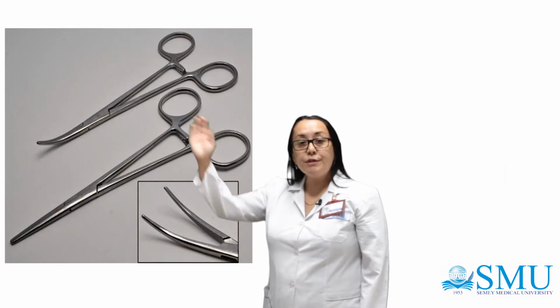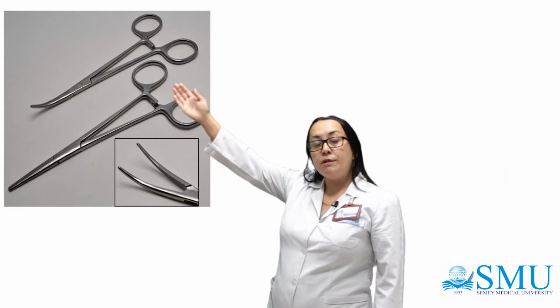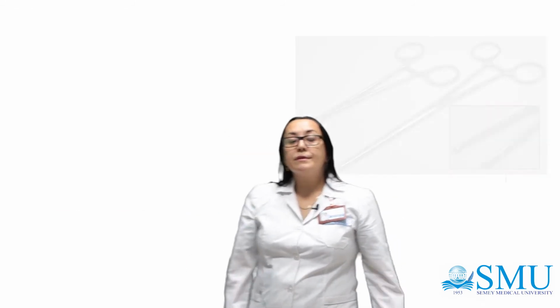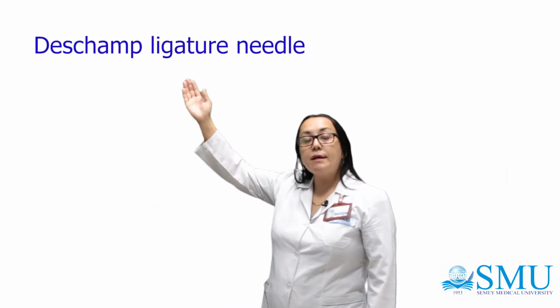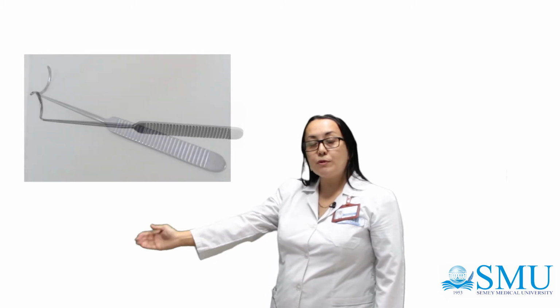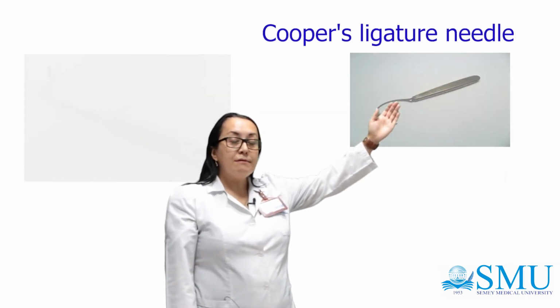Hemostatic clamps. They're used to control the bleeding. They can be curved or straight. This is Billroth's straight clamp and Billroth's curved clamp. Kocher's clamp, mosquito clamp. Deschamps' ligature needle. They can be blunt and sharp. Cooper's ligature needle.